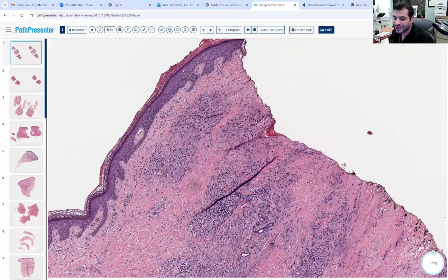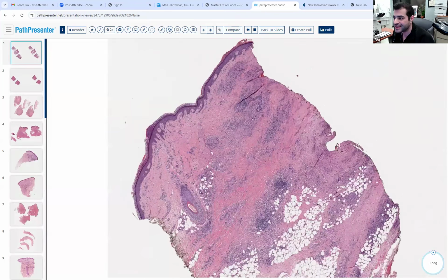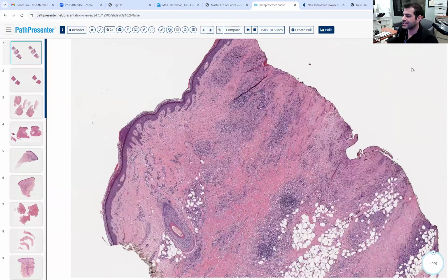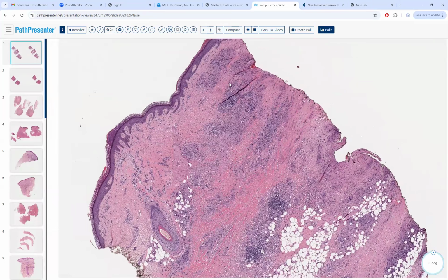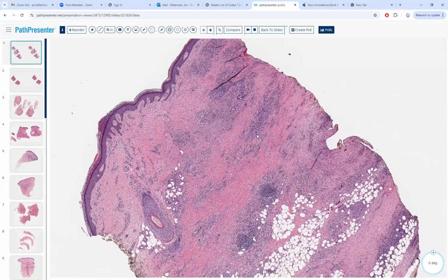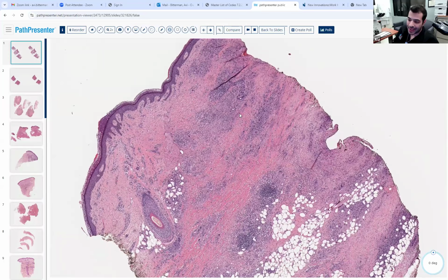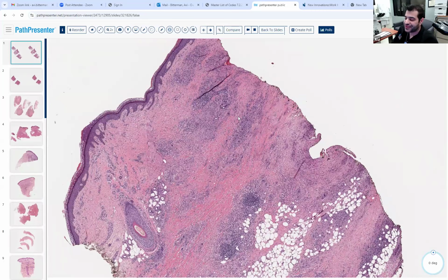So yeah, it's granulomatous. You mentioned the histiocytes. What are the things that differentiate this from GA? Why is this NLD and not GA? My understanding is NLD has a very layered appearance, and GA less so. There are many variants of GA, like interstitial and palisading, but that doesn't necessarily look like this. So top, bottom, side to side. Yes, agreed. What other differences between NLD and GA are there?